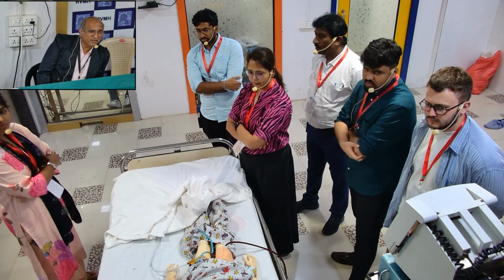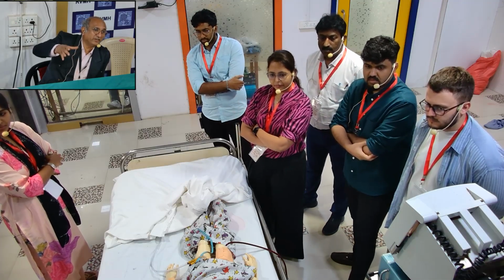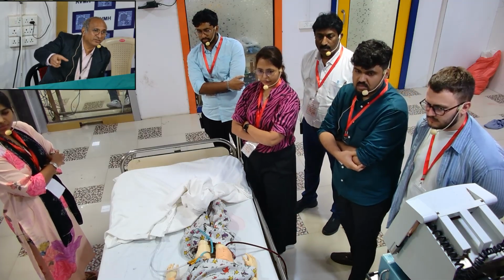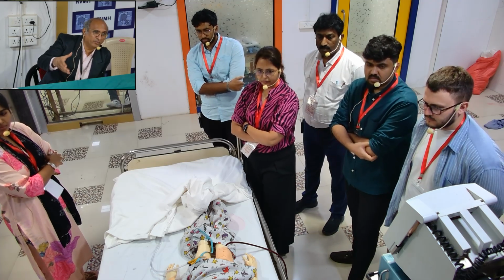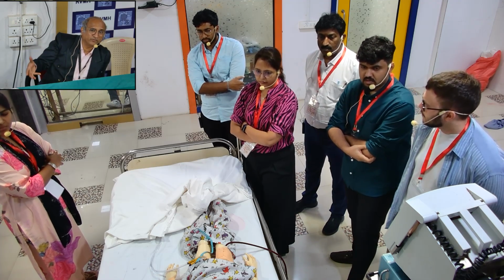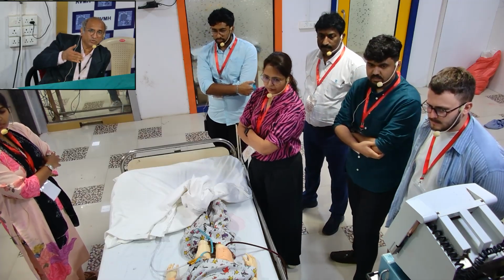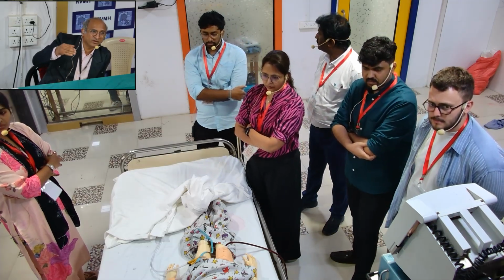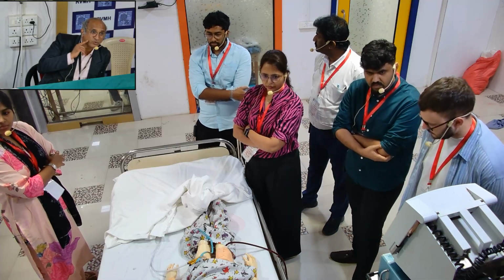Yes, but usually this is not going to come. As I told, that will come only when there is a tamponade effect. That's the last point I discussed. Because of the tamponade you can get a similar picture, either because of cardiac tamponade or because of tension pneumothorax. So that can also present like this, but that is usually going to be gradual. Your flow will slowly come down, and you will get chattering, and then the things will happen. May not be so rapidly.